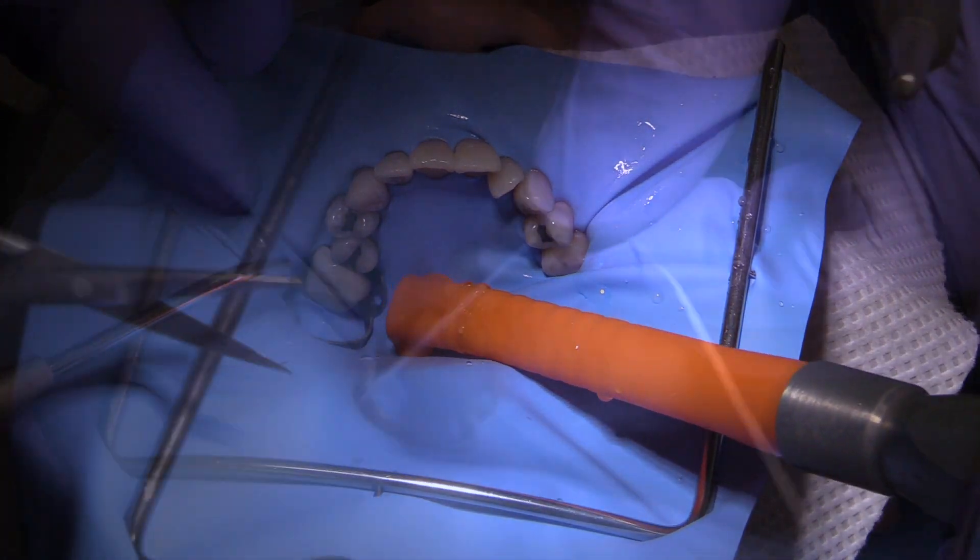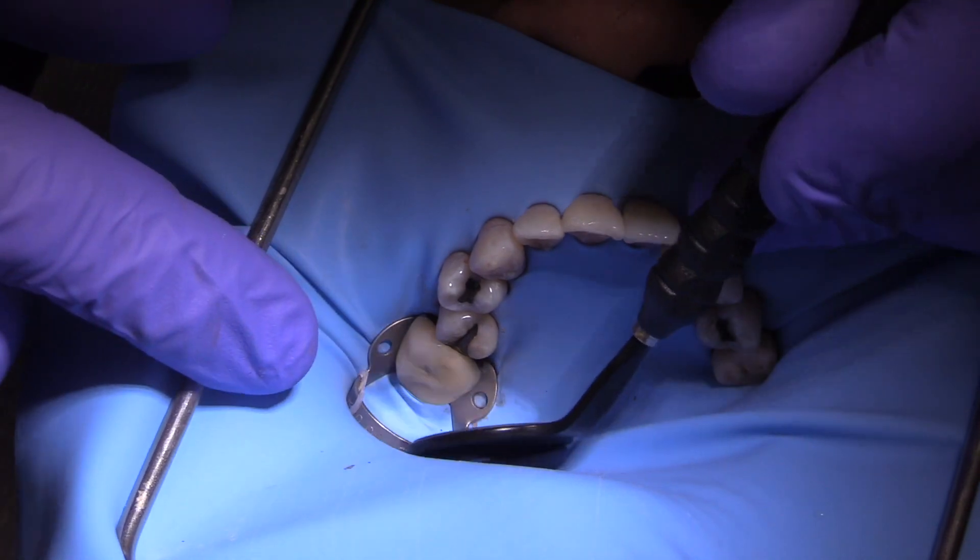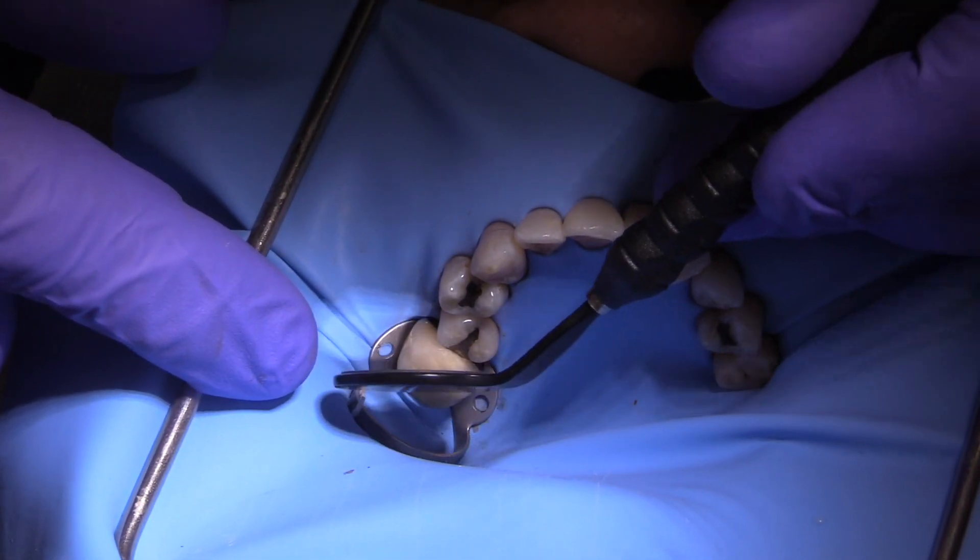Cut off the floss now because you don't need it for any safety purposes since the clamp is already in position, and inspect everything for seal.